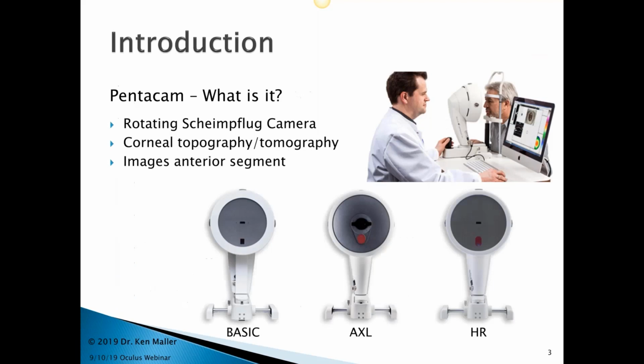Now let's get into the Pentacam and what is it? I'm sure some of you out there do have Pentacams, but some of you do not. And so this is kind of an introduction to Pentacam and what can we do with this, and how can we utilize the CSP and bring all this stuff together for our scleral lens fitting.